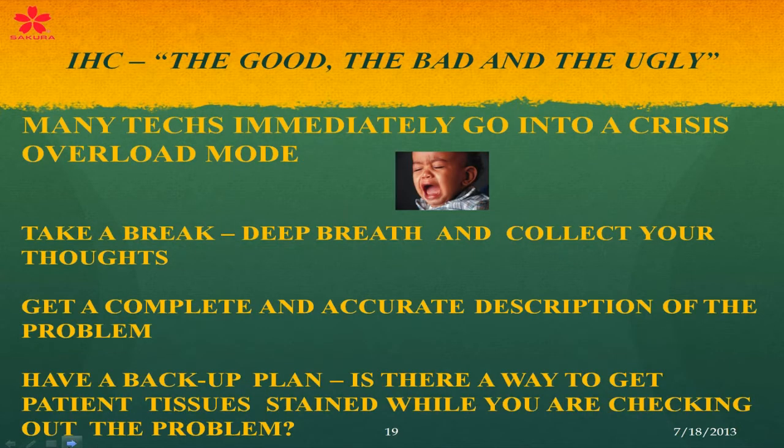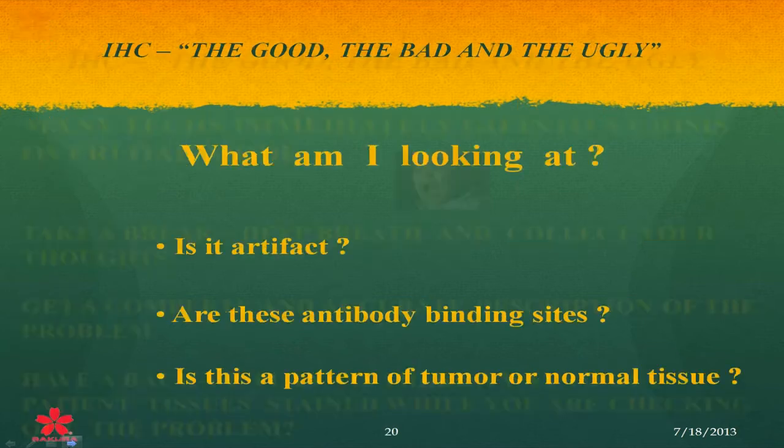Many techs immediately go into a crisis overload mode. Take a break, take a deep breath, and collect your thoughts. Get a complete and accurate description of the problem. Always have a backup plan. Is there a way to get patient tissue stained while you are checking out the problem? If you have another tech working with you, get them to take over so you can troubleshoot what the problem is.